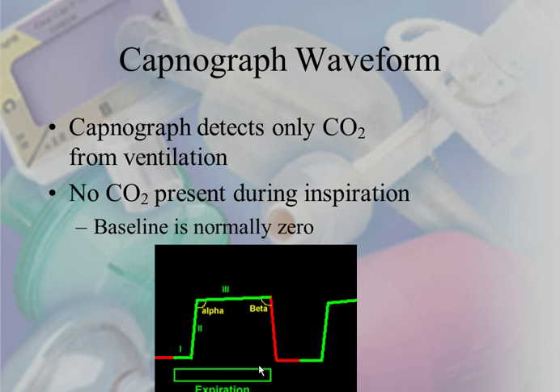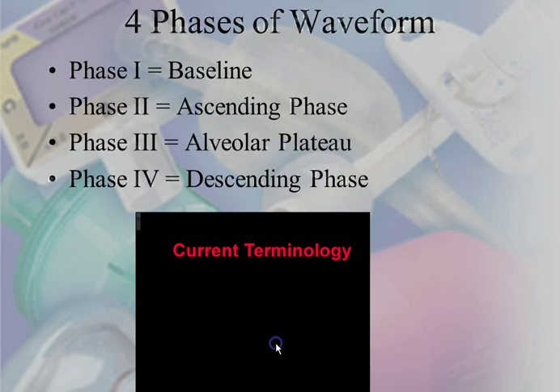Okay, so for the capnograph waveform, the capnograph detects only the carbon dioxide from ventilation, no carbon dioxide present during inspiration. So when you're taking a breath in, that is right here. As you're taking the breath in, it's this. Okay?